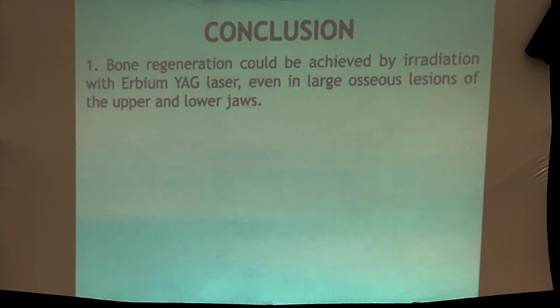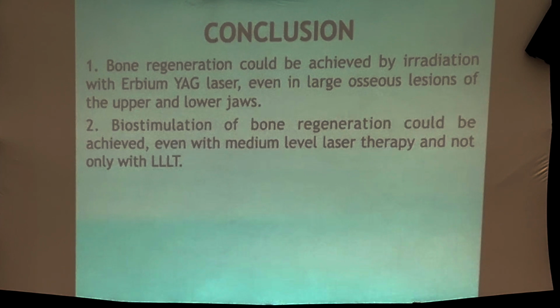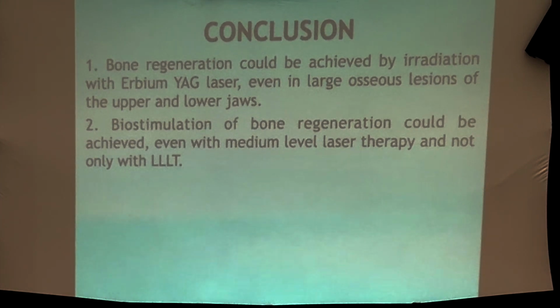Conclusion. Bone regeneration could be achieved by irradiation with erbium YAG laser only, even in large osseous lesions in the upper and lower jaw. Biostimulation or photobiomodulation of bone regeneration, very difficult words. It's a regeneration, okay? It could really be regenerated and achieved with the laser use only.